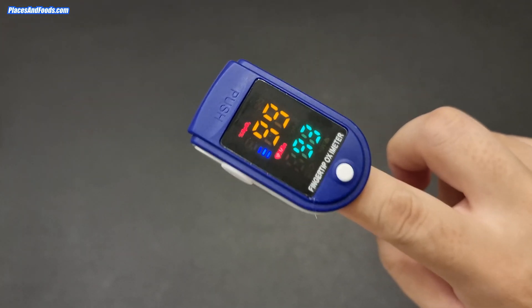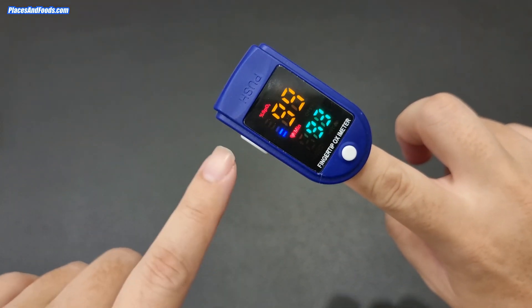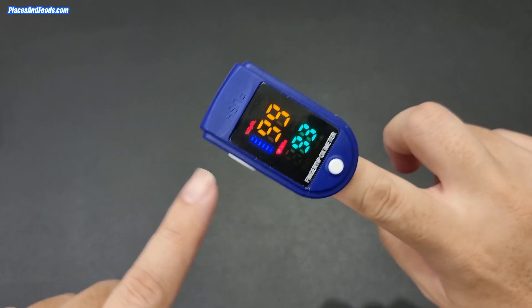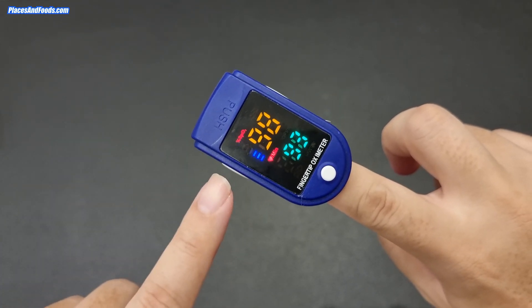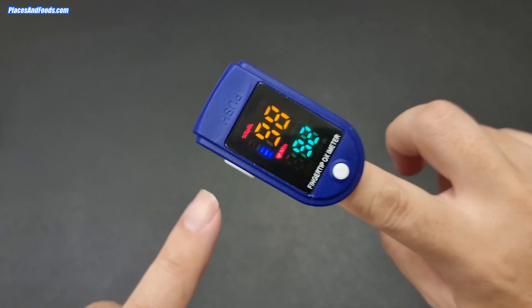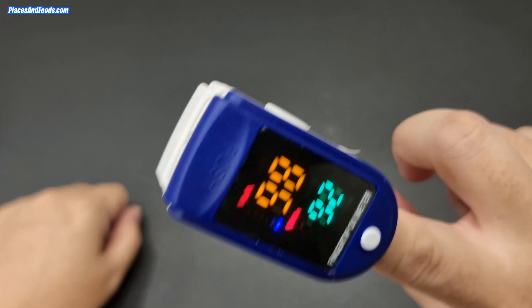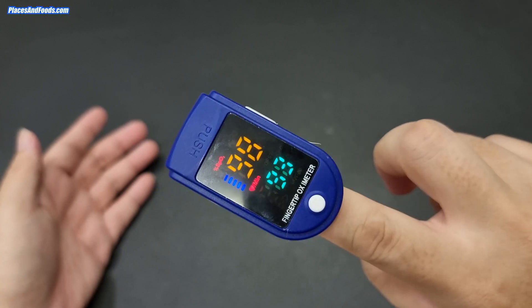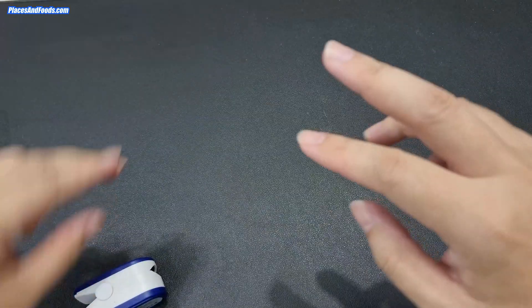A lot of people are getting this right now because one of the early detections of COVID-19 is the oxygen level in your lungs. What happens if your oxygen level is less than 90? You can see it's reading — I'm getting around 93. If it drops below 90, your oxygen level has suddenly dropped and many people say you should seek medical advice or get a COVID test.